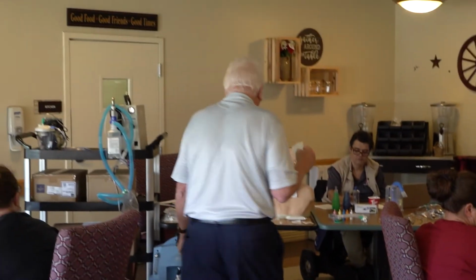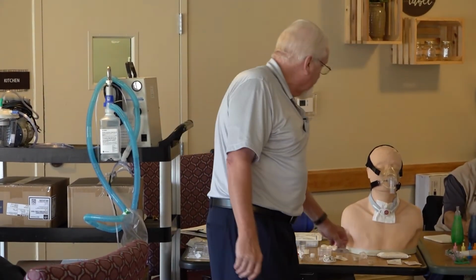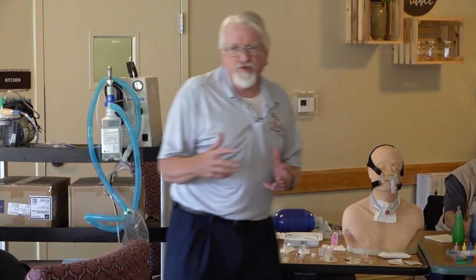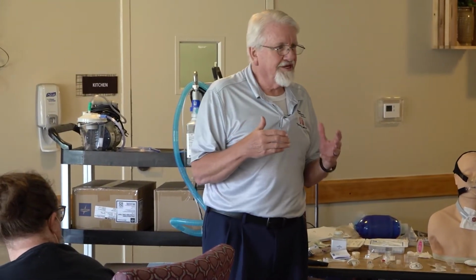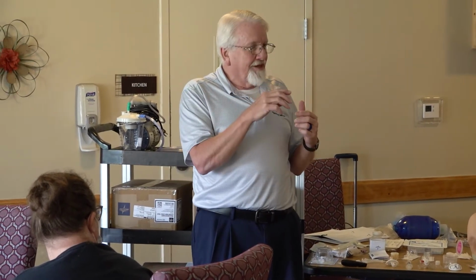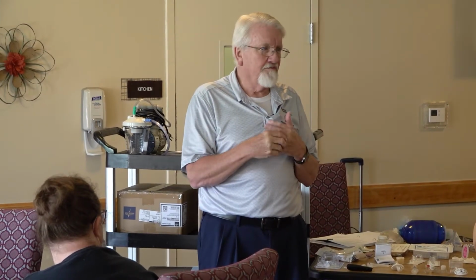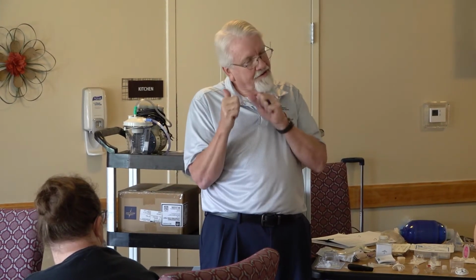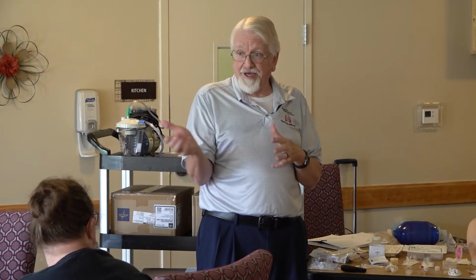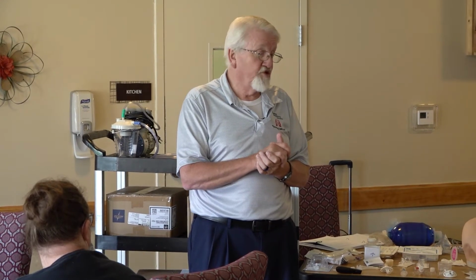Most of your laryngectomy patients use Atos Medical, and the products are Provox. The doctors stay connected with Atos Medical. So if you were to call and say, we're getting a laryngectomy patient here tomorrow, chances are their rep already knows that, but we would call them and say, hey, at Logan, we're getting a laryngectomy patient tomorrow around 2.